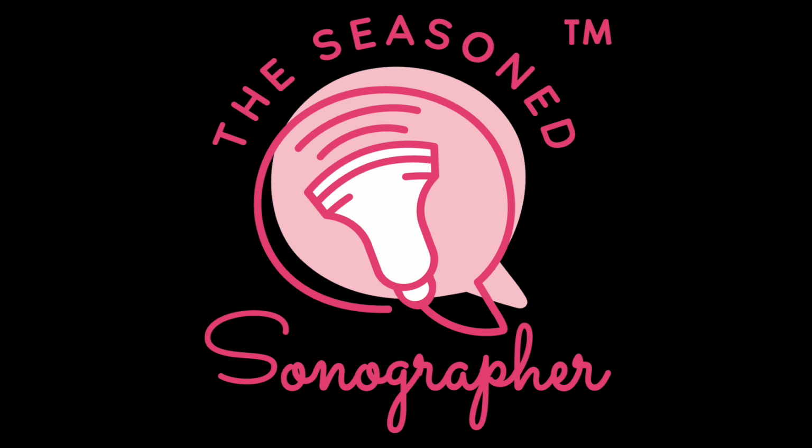So the physician took her to surgery to remove the ectopic pregnancy, and there was no ectopic to be found. She followed up in our office to find the intrauterine pregnancy or a possible molar pregnancy or figure out what was going on. And it was just a normal dating scan. I put the vaginal probe in. I adjusted my depth, my gain and focus.